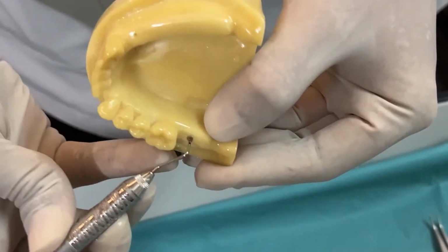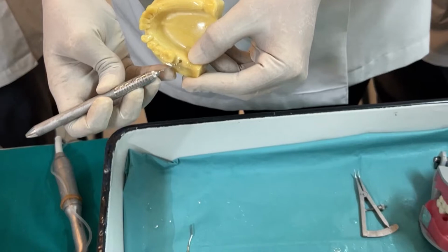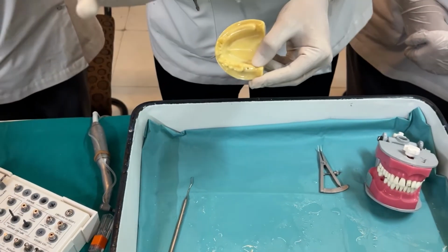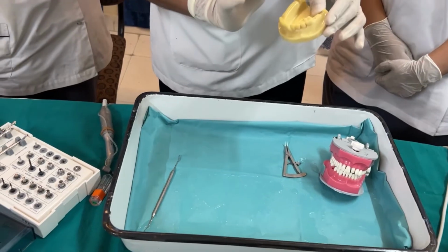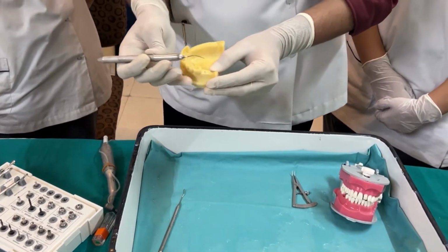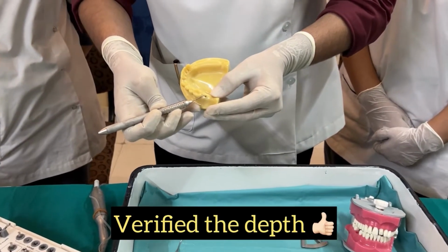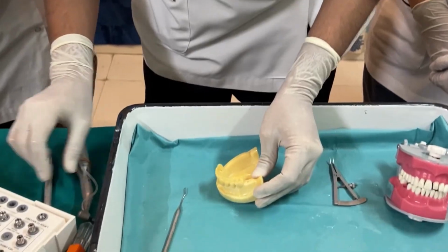Again I say the first rule of surgery is safety first. So what you are supposed to do is ensure that it is not dipping inside. You are reaching rock bottom. That means you haven't caused any perforation or entered any vital structure. Okay. So now I have verified the depth, and once I have verified, I can continue with my osteotomy.